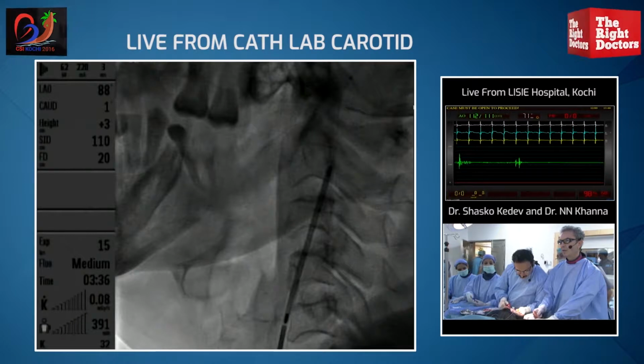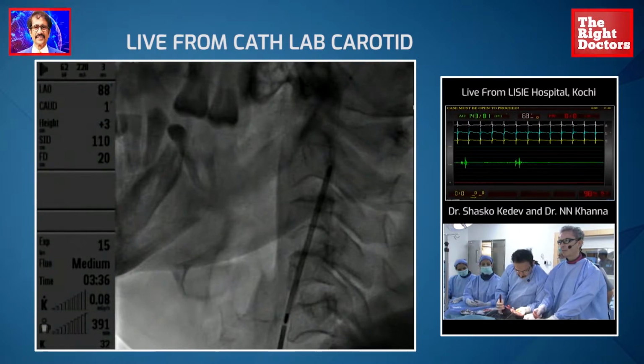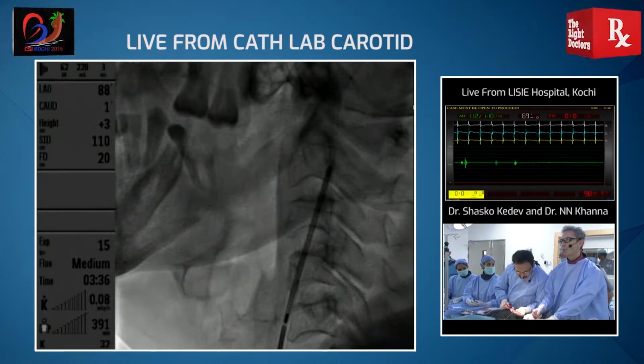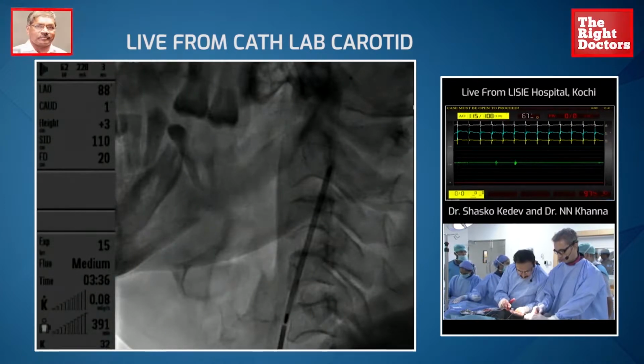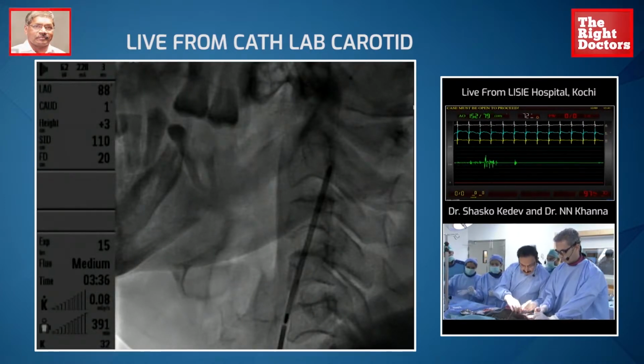Yes, in 2 weeks we do control CT, and if there are no changes, then we proceed with revascularization. Wait. Yeah, we'll change this. There's some problem here.